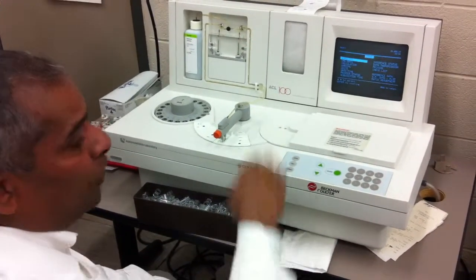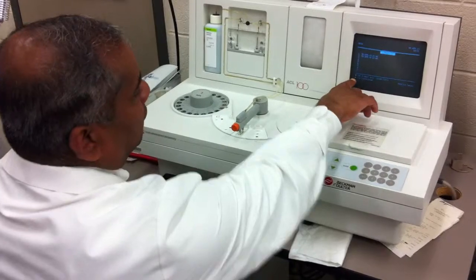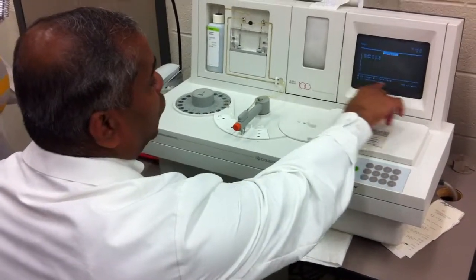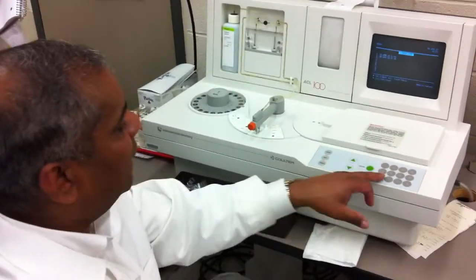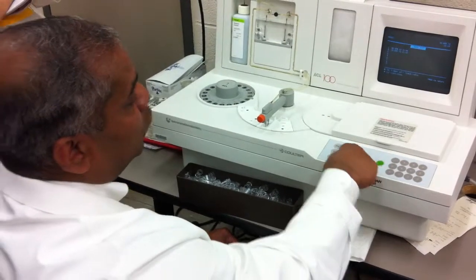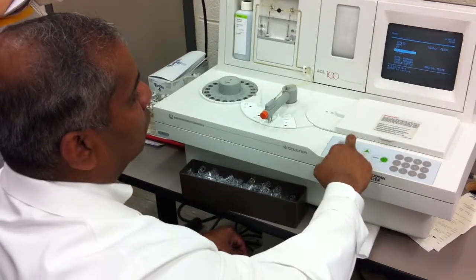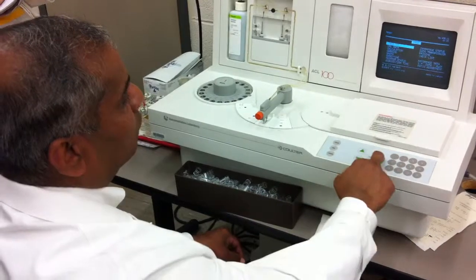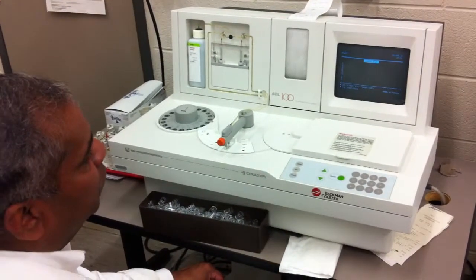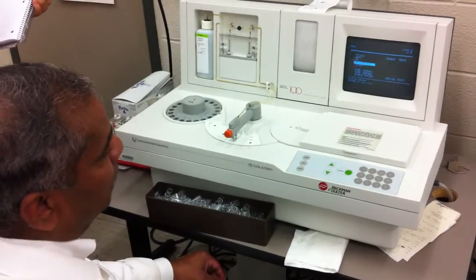So if all of it was used up, then if you press enter on the load list, it will allow you to clear it. See that? It tells you what to select and what arrow to use, the up and down arrow. So it's telling me to clear the load list. If I want to clear all the load lists, I press the up arrow, then enter, okay? So you see, it's gone, right? All I did was press program twice. Okay, so now the load list is clear. I'm back to the main screen by just pressing program.